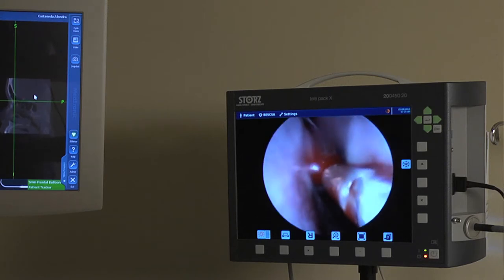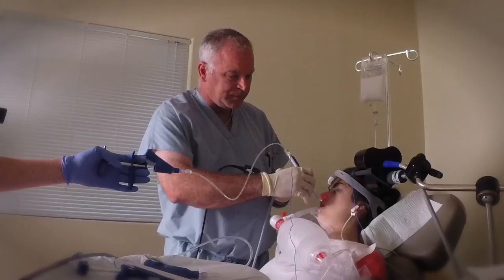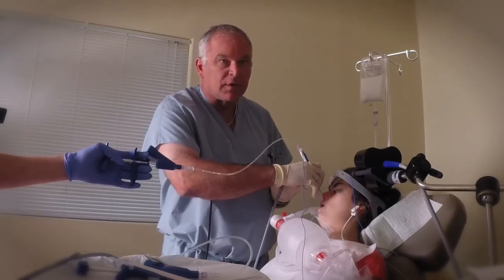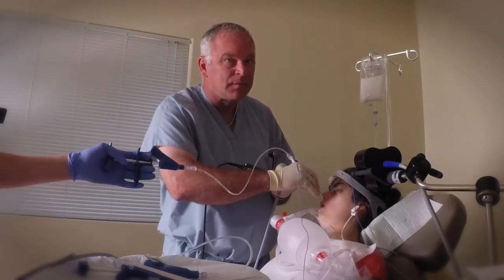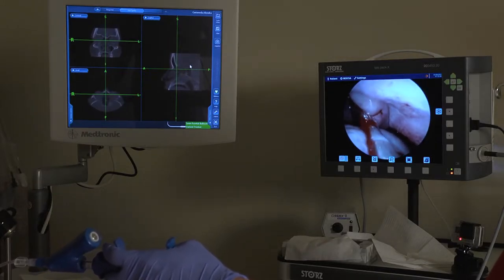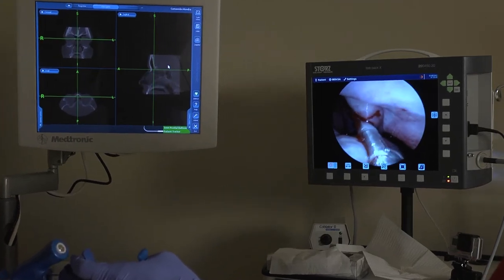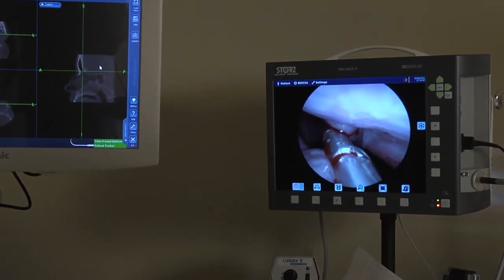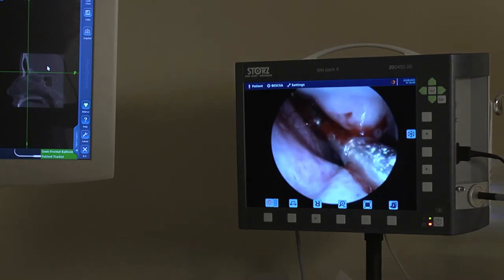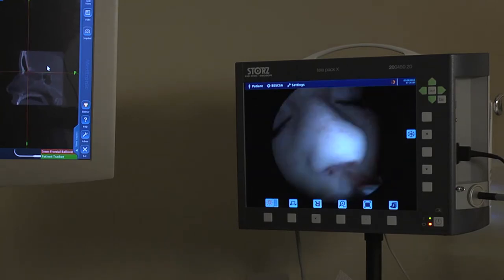And we come back out. As you can see, it's relatively bloodless. Using the navigation system allows you to get into the sinus accurately. Now we're going to do the frontal sinus on the right side. Again, this is your middle turbinate. And working the balloon — I'm watching my computer. As you can see on the right-hand shot on the computer screen, the balloon is already up into the frontal sinus. So we'll inflate the balloon. You can see the balloon inflate on the screen. So both the frontals are done.